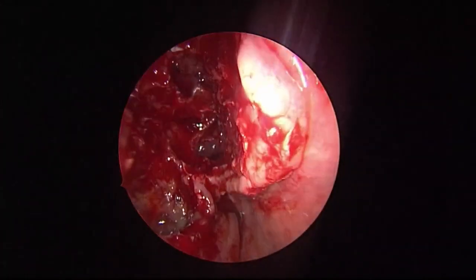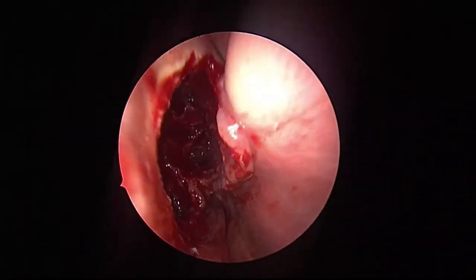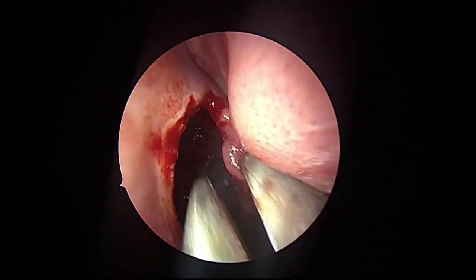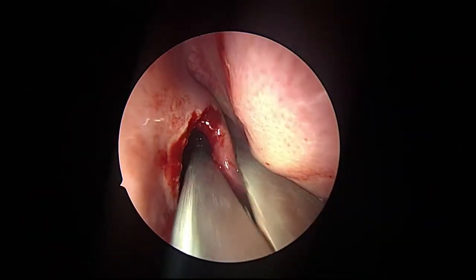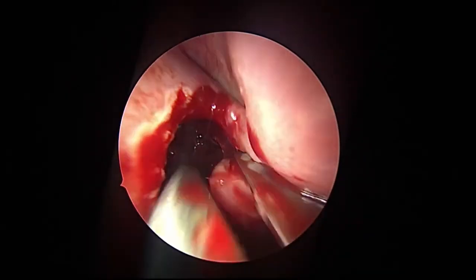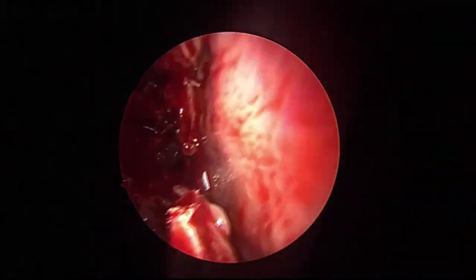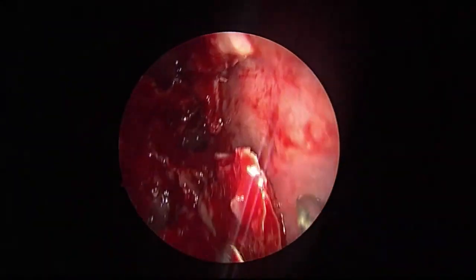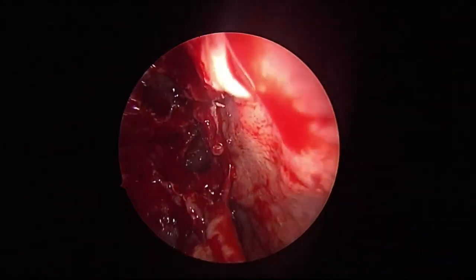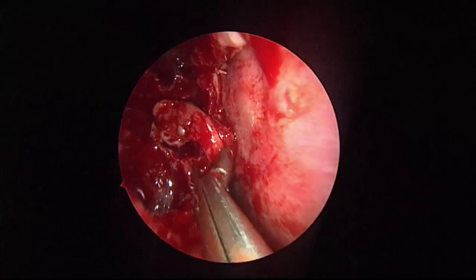Just see, the aim of removal of this part we do in the end, and it will not be a complete chop. The upper part can be preserved as a landmark for the future. Only the lower part. See now, my access to this olfactory region for topicals to reach has improved. That's the whole aim of doing that.